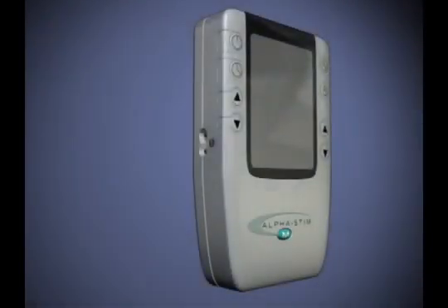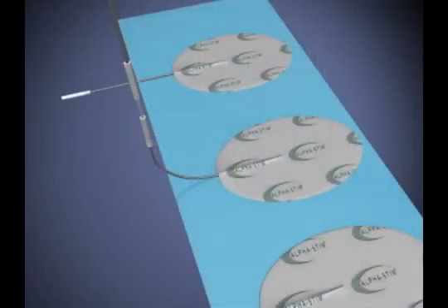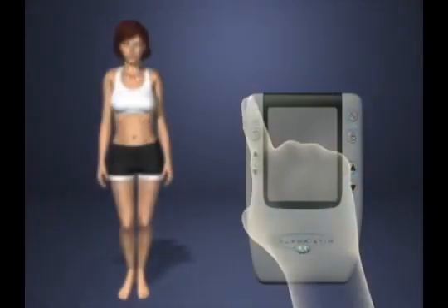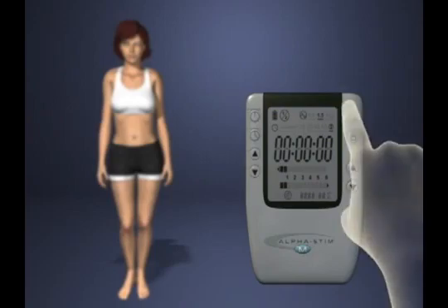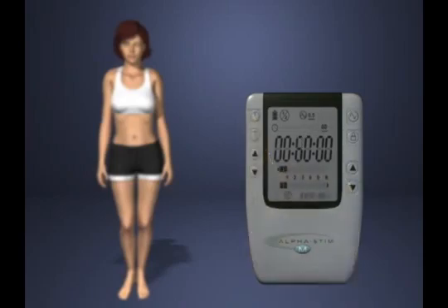To treat pain with Astrode electrodes, plug the dual connector end of the wires into channel 1 and/or channel 2 and the pin plug into Astrodes. Press power on. Set frequency to 1/2 Hz or desired setting. Set timer to 10, 20, 40, 60 minutes or continuous. This depends on the length of time necessary to effectively manage your pain.